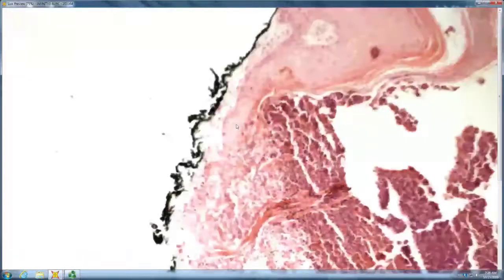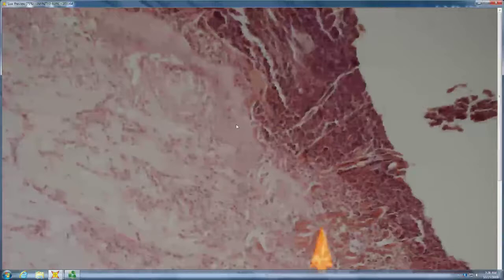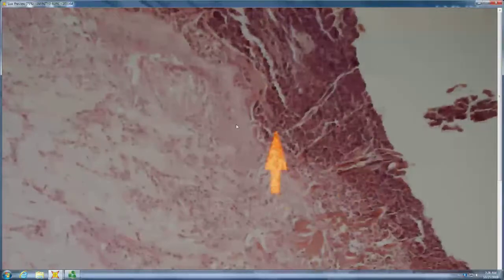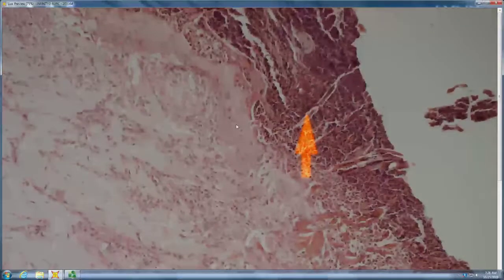I think elastic. You are correct, it's collagen. So, vertically oriented being spit out. In EPS, you never have vertical unless it's collagen. Okay, big bundles, vertical is always collagen.